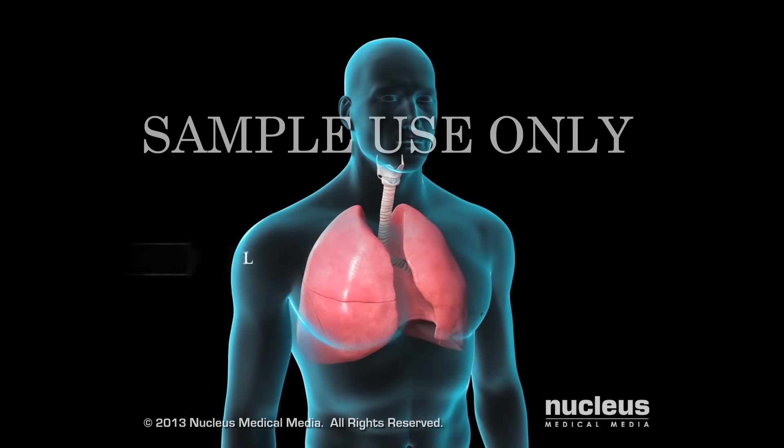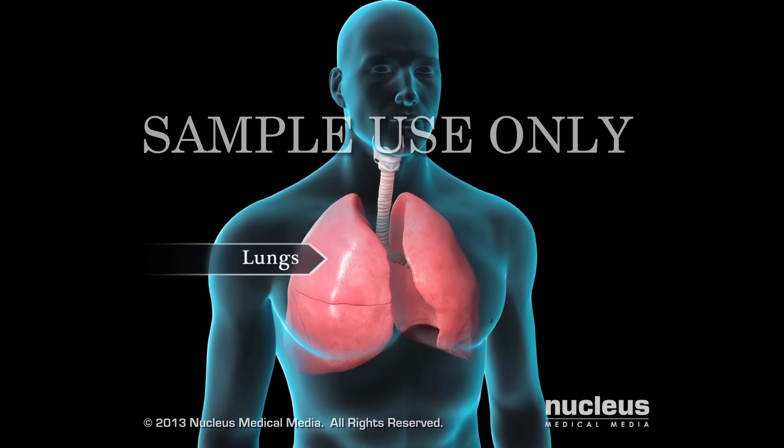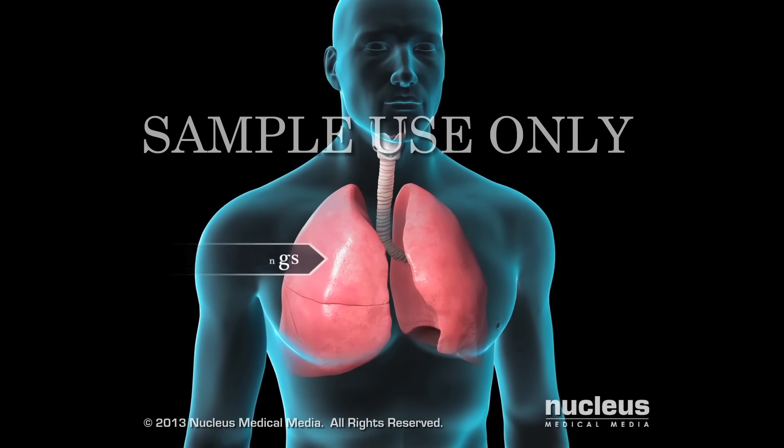Spirometry is a test of how well your lungs are working by measuring how fast and how much air you can breathe in and out.